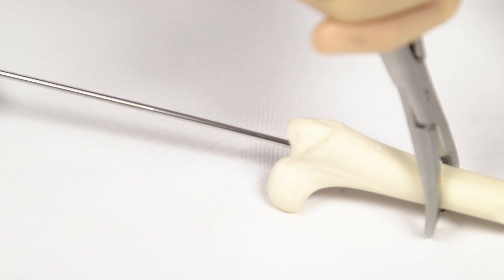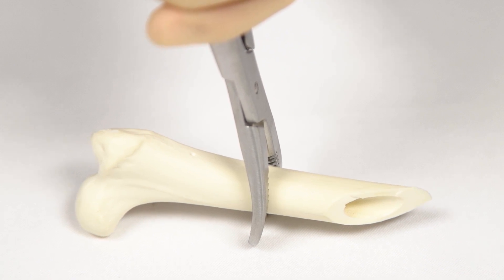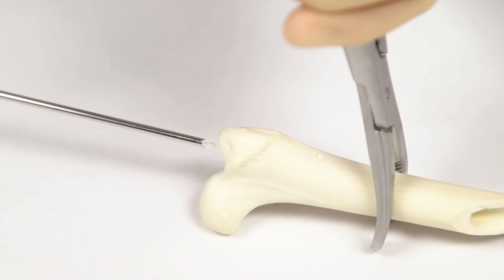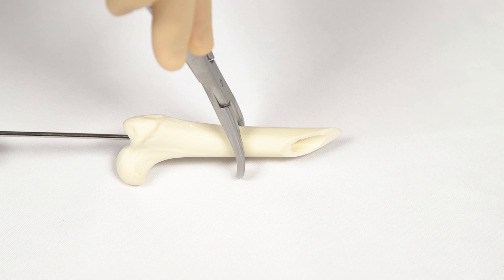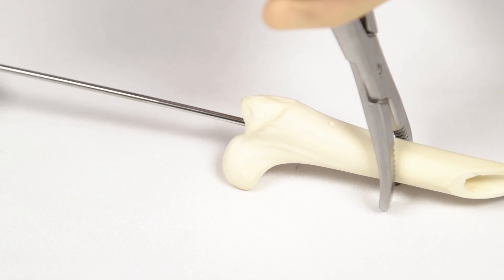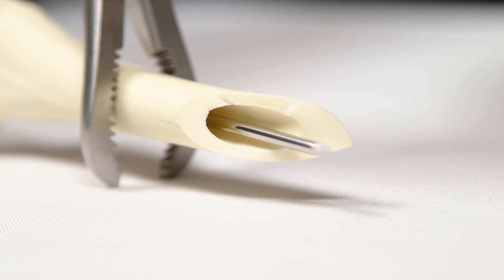Normagrade insertion of an IM pin is preferred as it gives better control of the bone entry and exit points. Holding the proximal segment of the femur using bone-holding forceps, the pin is walked off the greater trochanter medially until it drops into the intertrochanteric notch. It is then driven gently into the bone, directed parallel to the long axis. Resistance will be felt at first, but should drop once the pin has fully penetrated the cortical bone of the trochanteric fossa. The pin is then driven down the medullary canal until the tip protrudes at the fracture site mid-diaphysis.